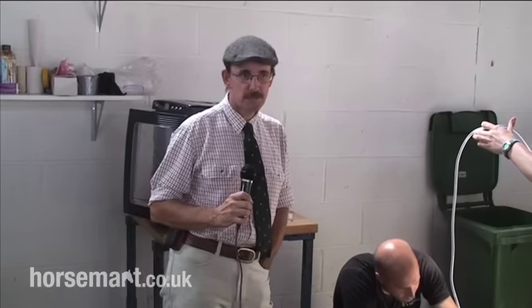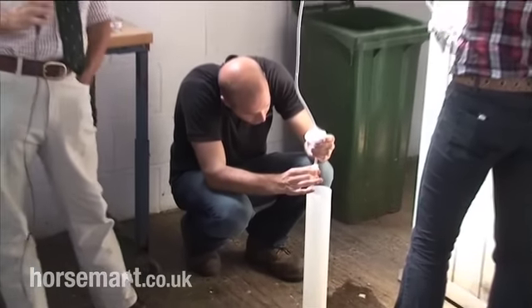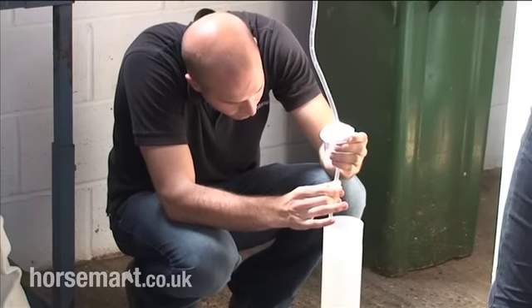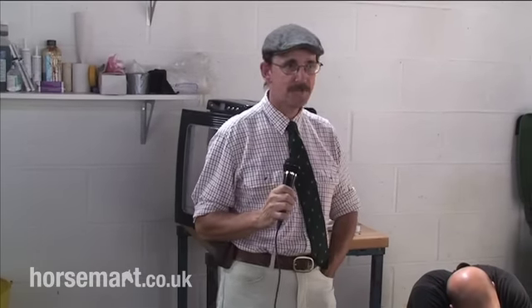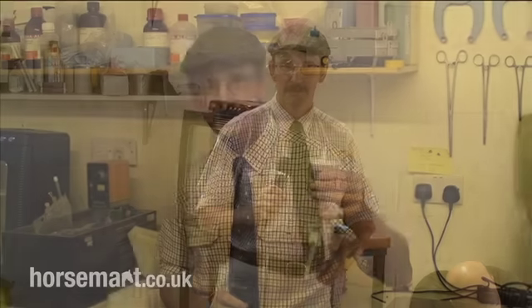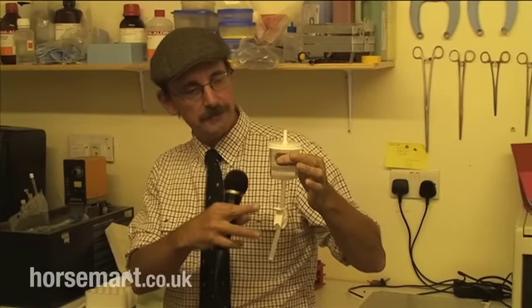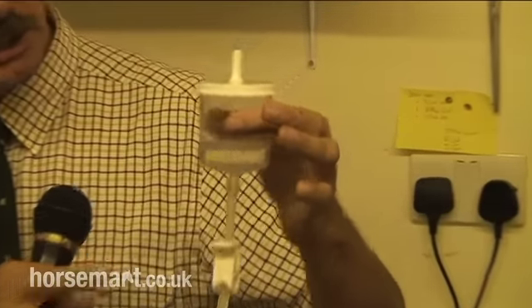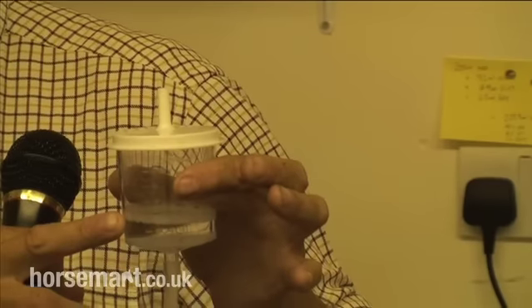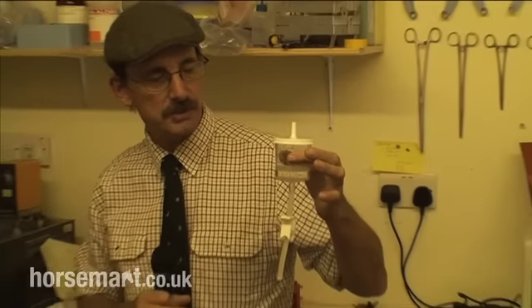Once the mare has been flushed, the embryo hopefully will have been trapped in the filter, which we're looking at here. That will be taken back to the lab and a search will be done. The mare herself can go off and continue her career, whether she's a competition mare, going to be bred again for another foal this year, or even possibly be sold. We're going to draw fluid up into a needle and syringe, drain down the filter slightly, rinse off the lid, remove air bubbles, and transfer the remaining fluid into the search dish. Then we'll go under the dissecting microscope and search for the embryo.